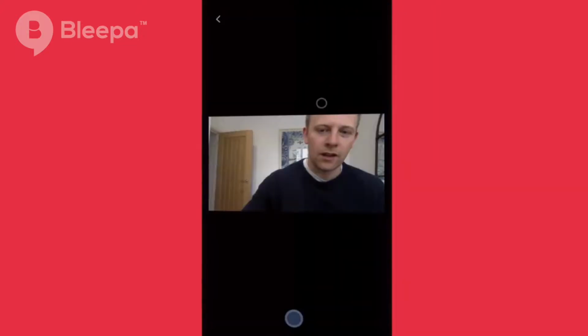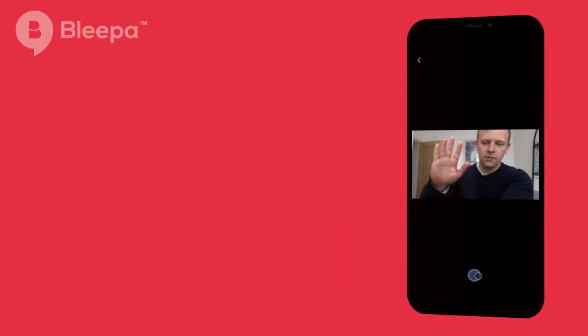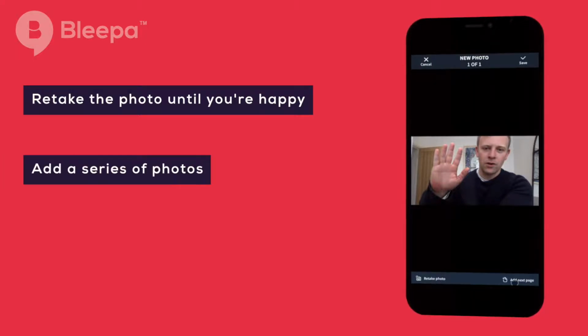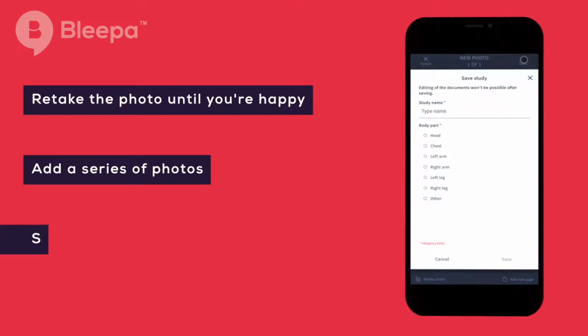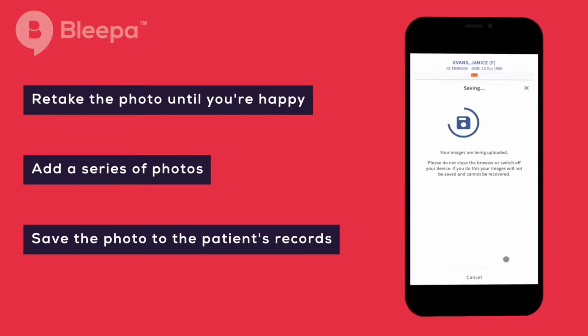Come to continue, and you can now see the patient image capture. So if I raise my hand and acquire the photo, if you're not happy, you can retake the photo, or you can add another photo to display another feature of a patient. Perhaps if you want to capture two aspects of a limb or two aspects of a mole or rash. Press save, give it a title, select the body part, and press save.